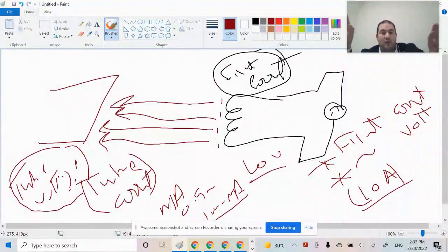The filament voltage is what heats the electrons inside the filament circuit, while the tube voltage is applied externally to accelerate the electrons from the cathode to the anode. I hope this is clear for you in answering the questions. So, what are the other points that might need discussion?